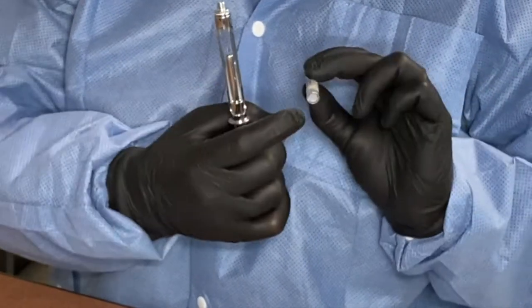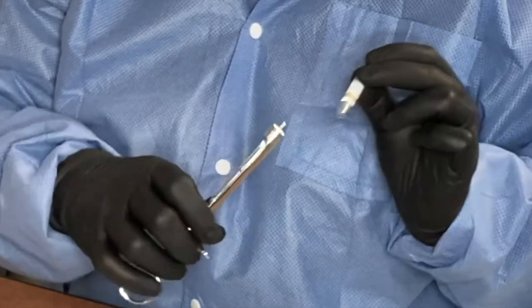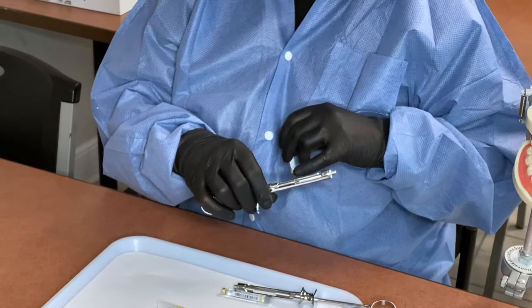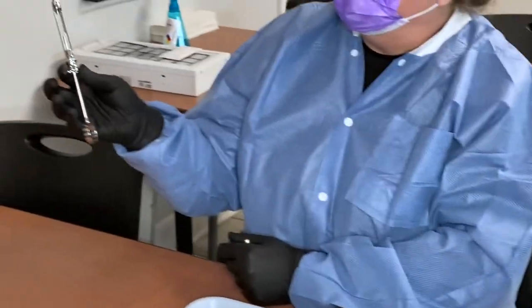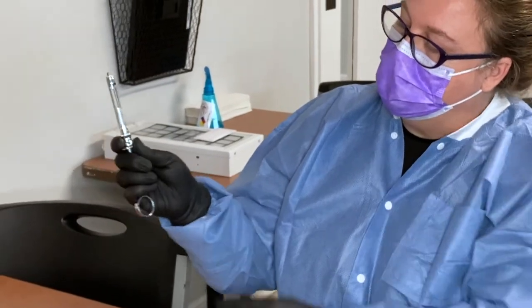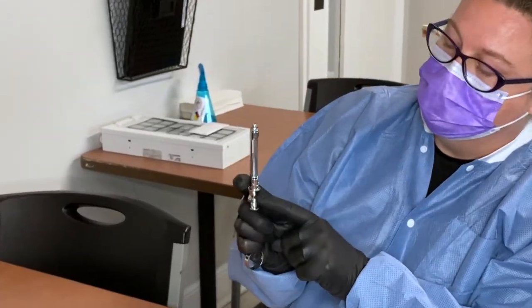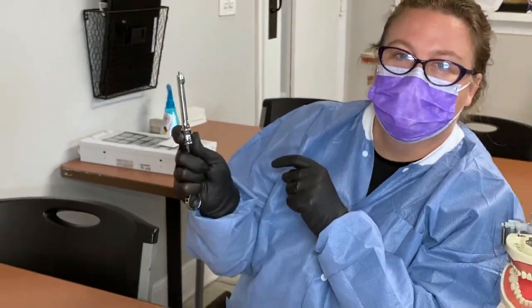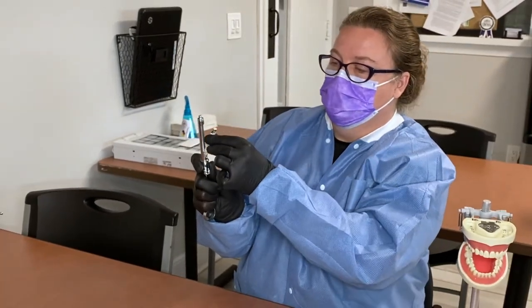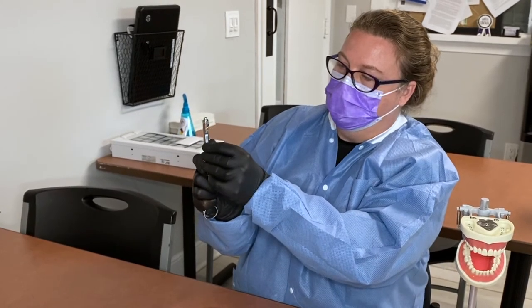This is the top, this is the bottom. This little rubber stopper inside is going to go down towards the harpoon. Hold the carpule in one hand and push up while pulling down at the same time — take your thumb on the little wings, push up, pull down, put the rubber stopper in, and let go.